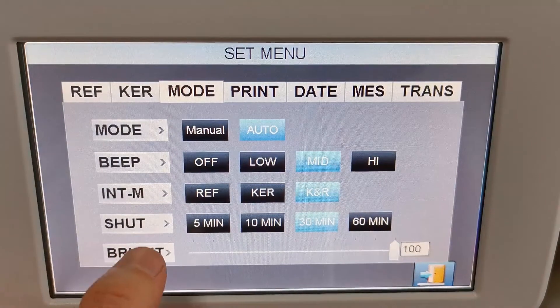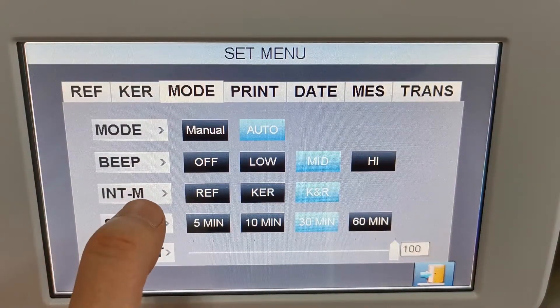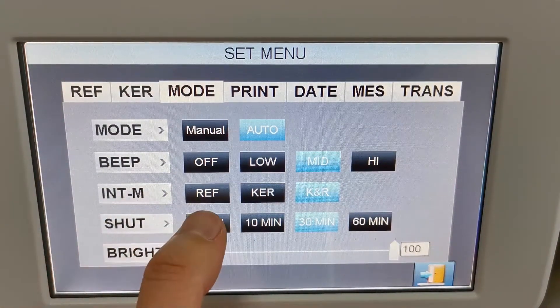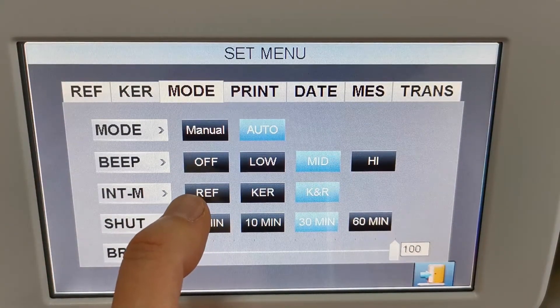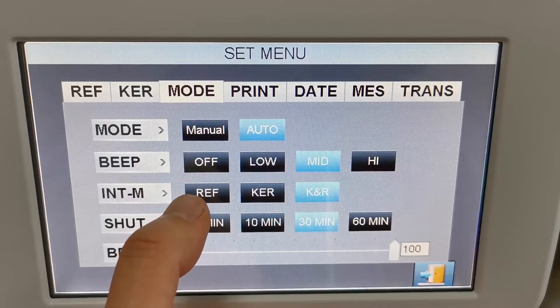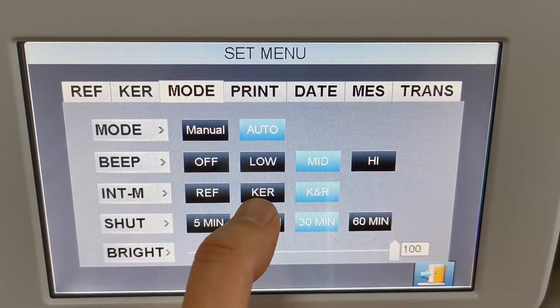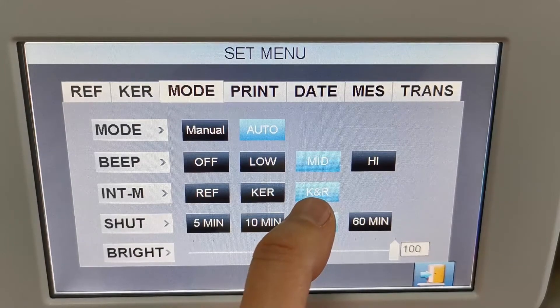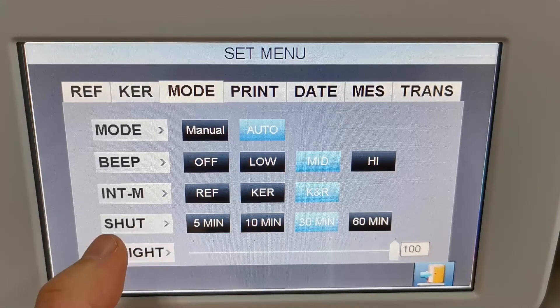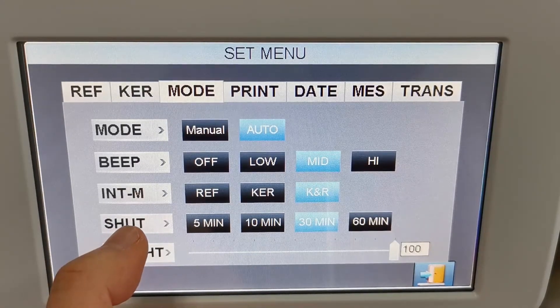And here is the measurement mode — you can have refractive measurement only, keratometer measurement only, or both functions together.